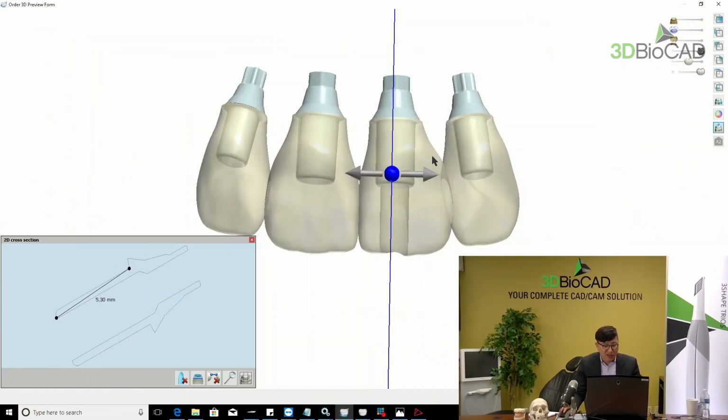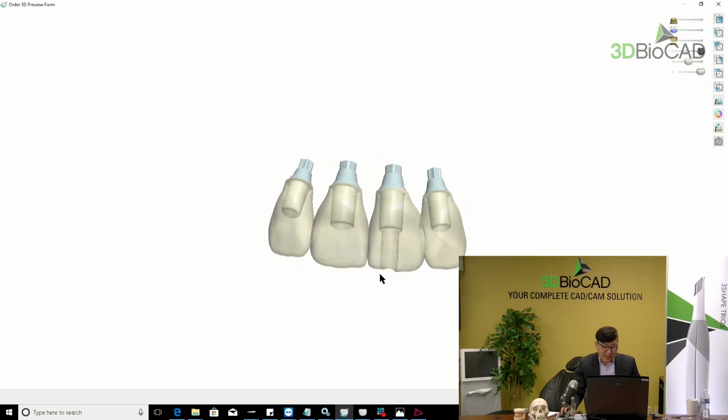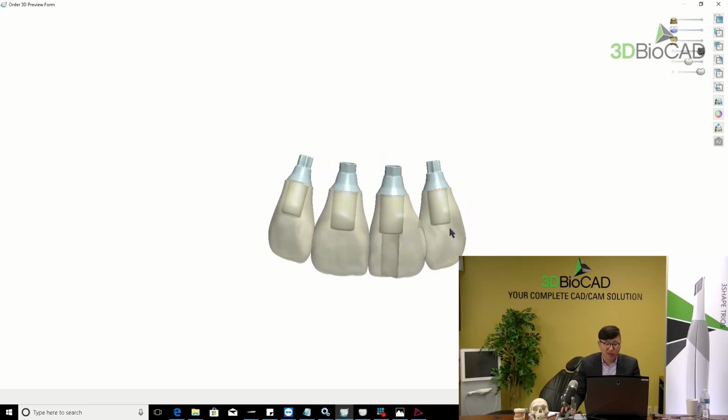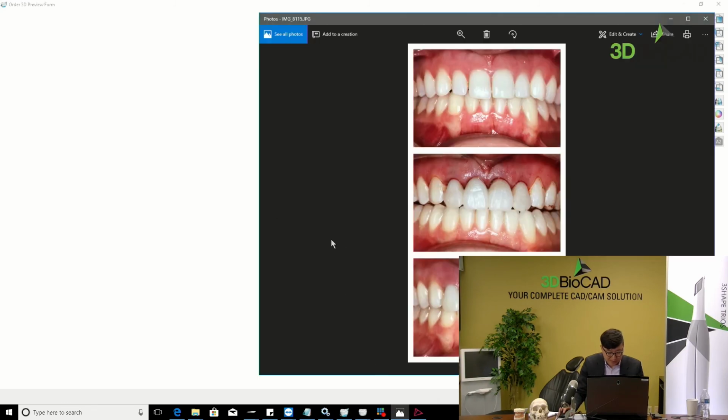So after cutting the cylinder, the doctor does the surgery, puts the titanium in first, and then tries to put it in the bridge. Or if the angle is so different, the doctor needs to put the titanium cylinder in the bridge first and then try it in the patient's mouth. Both ways should be fine. So PMMA, titanium, I cut the titanium and delivered to the doctor in our location, probably he's in Osaka, Dr. Tariwar. Thanks very much again for sharing this photo. Let me just show you the photo.